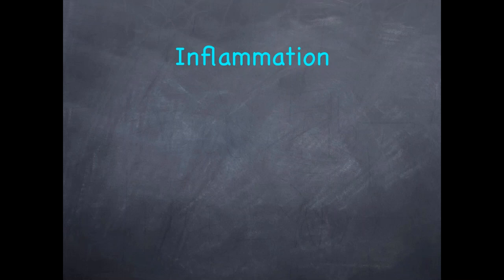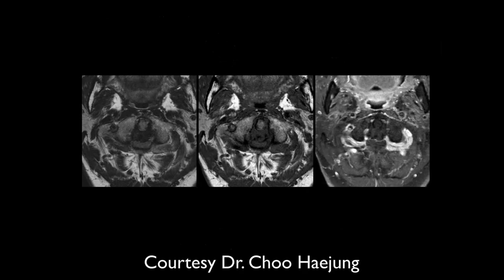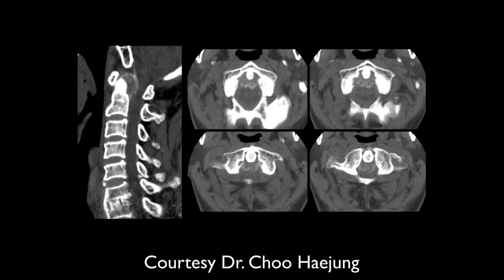Let's talk about inflammatory changes of the cervical spine. There's some thickening posterior to the dens and some narrowing of the canal at that level — this could be synovial thickening. Rheumatoid doesn't look like this, and this is non-enhanced, so you can have calcified synovial processes.